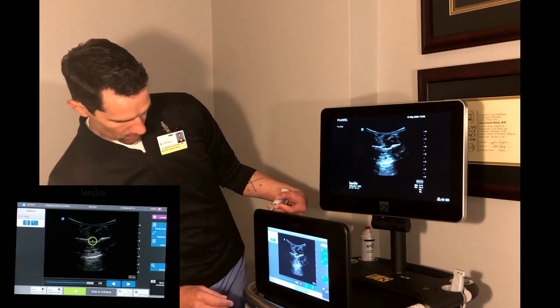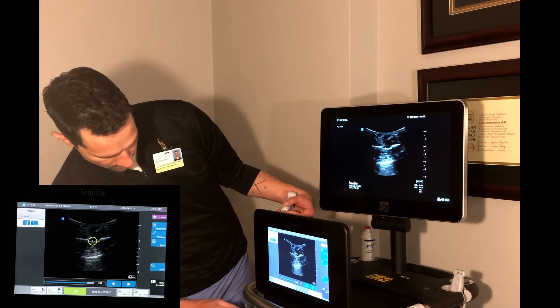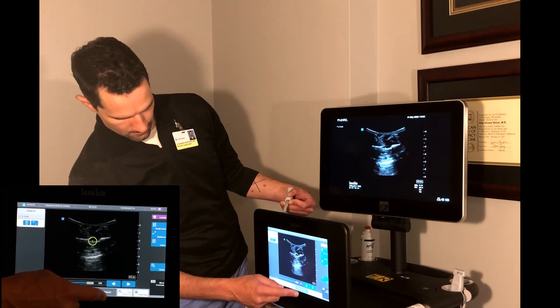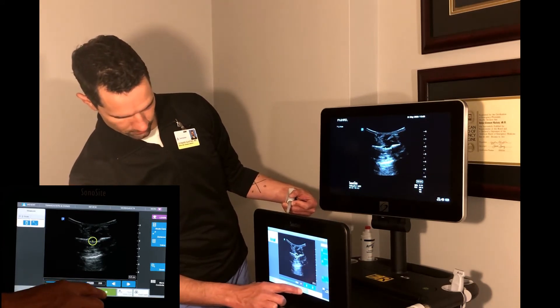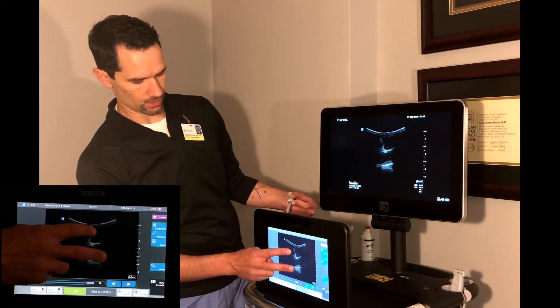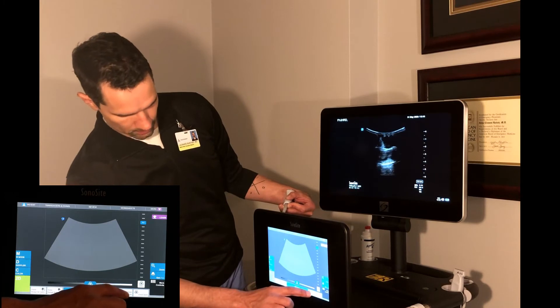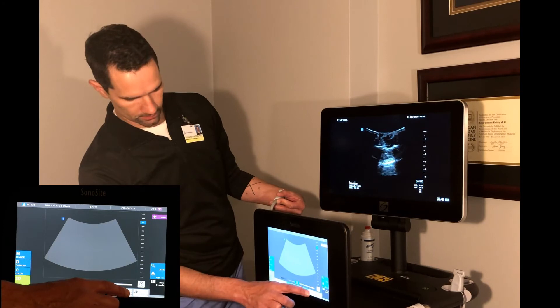If you want to save an image, you can hit 'Save Image and Calcs' in the lower left-hand corner. To unfreeze, you can slide the bar to unfreeze, or do two fingers on the touchpad at any time to freeze and unfreeze. If you want to save a video clip, hit the video clip button and then hit save when done.